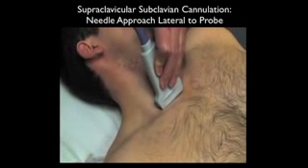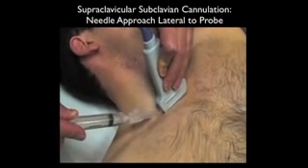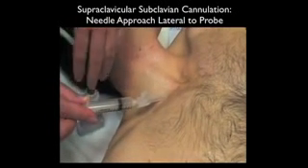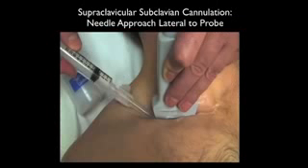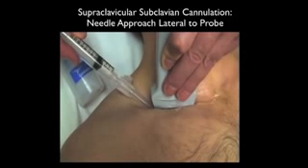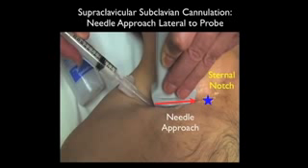Next we add ultrasound — placing the high-frequency linear array probe into the supraclavicular fossa just above the subclavian vein. We'll place the needle on the lateral aspect of the probe so we can watch the needle come down into the vessel, following the standard trajectory from the lateral aspect of the clavicular head of the sternocleidomastoid towards the sternal notch. Here we get a different perspective for probe placement in the long axis configuration in the supraclavicular fossa, with the needle oriented off the back or lateral to the probe, kept visualized at all times as it goes down to the vessel.